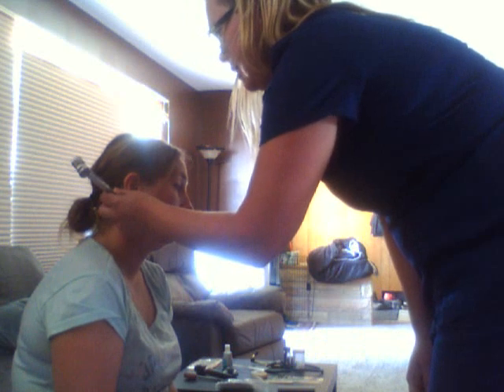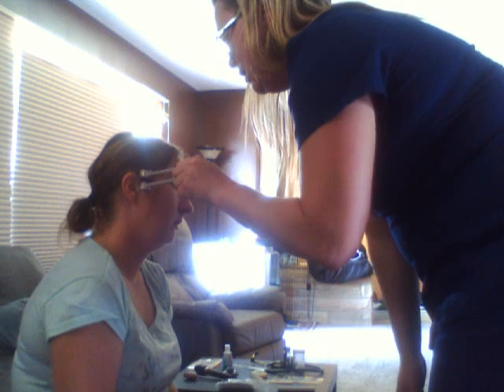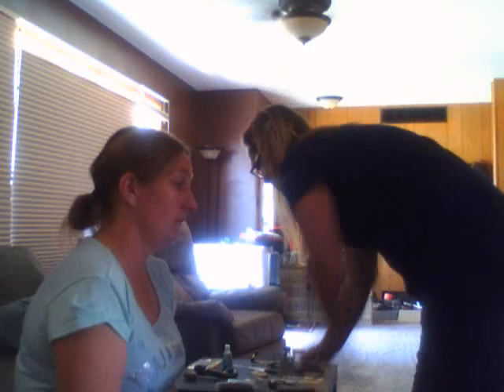Okay, tell me when it stops. Okay? Now tell me when you can no longer hear that. Okay, and that is all within normal. It is double the amount of time that was on the mastoid process. Now I am going to check the inside of your ears with the otoscope.